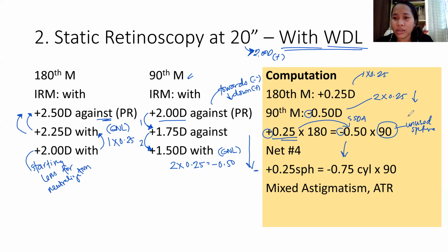Okay, so this will be our new axis. Okay, so this one is mixed astigmatism against the rule.